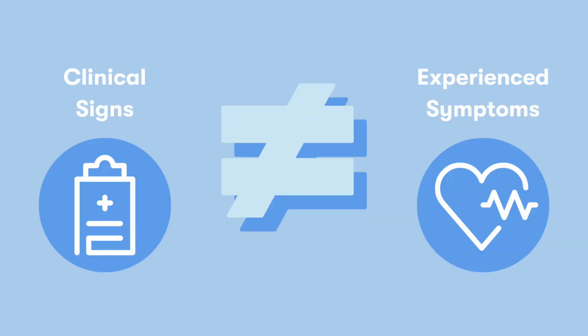Now that we've walked through some of the diagnostic tests, it's good to know that these are important objective measures of your dry eye severity. Sometimes the patient's experienced symptoms may not match these clinical signs or vice versa, and that's why it's very important to use these measures as trackers of the patient's treatment progress.